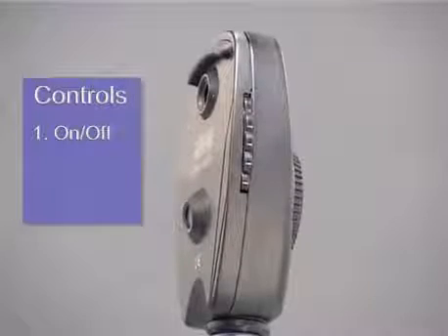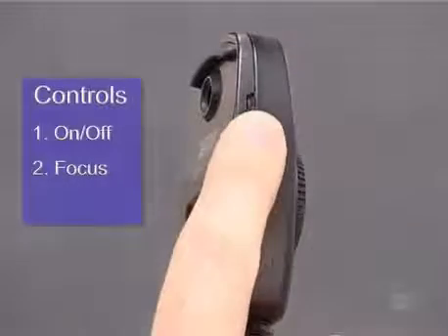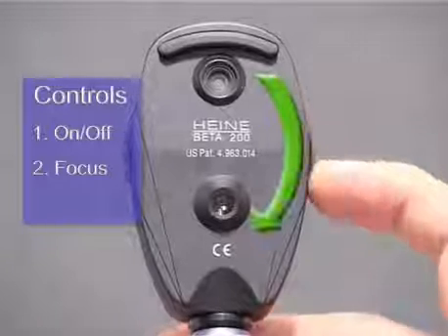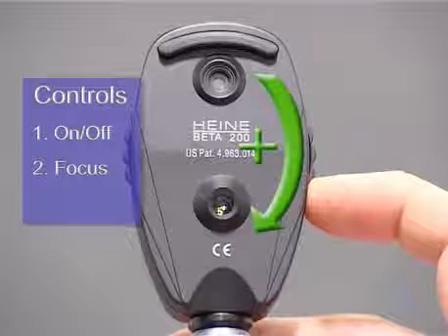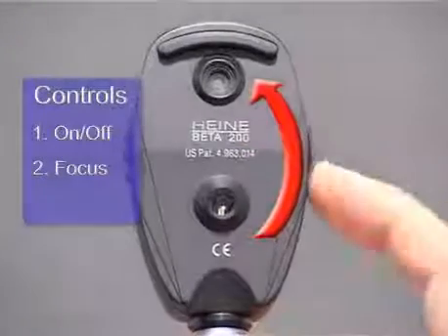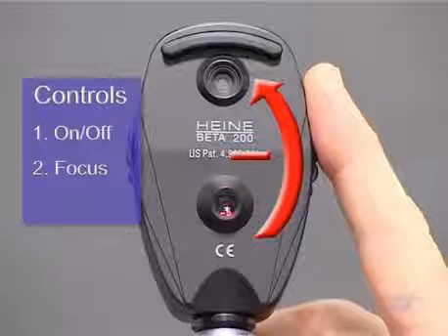Secondly, there's a lens wheel which adjusts the focus. This is mounted in the head of the instrument and carries a graduated range of lens powers around its edge. Dialing this wheel clockwise increases the lens power, which moves the focal point nearer the observer. Conversely, anti-clockwise rotation effectively decreases the power of the intervening lens, which moves the focal point further away from the observer.